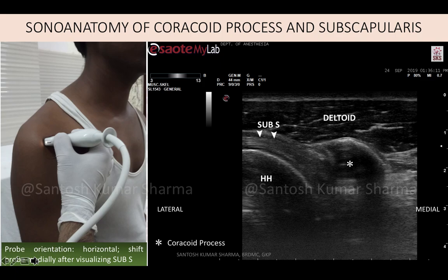And here I would like to stress that the coracoid process and subscapularis must be viewed because you can find anteromedial or subcoracoid impingement syndrome, where the subscapularis tendon impinges over the tip of the coracoid when the arm is flexed forward and in maximal internal rotation. Also, one can find some subscapularis cyst and bursa in some cases.